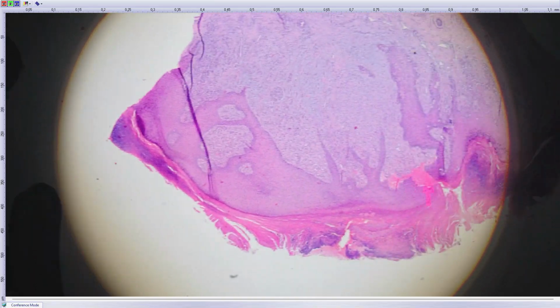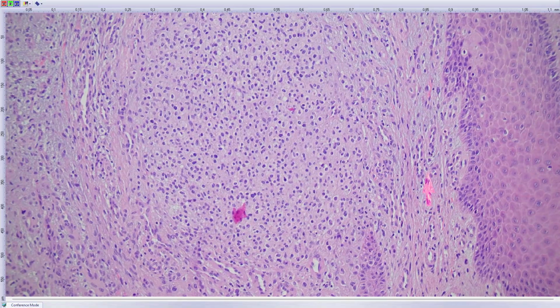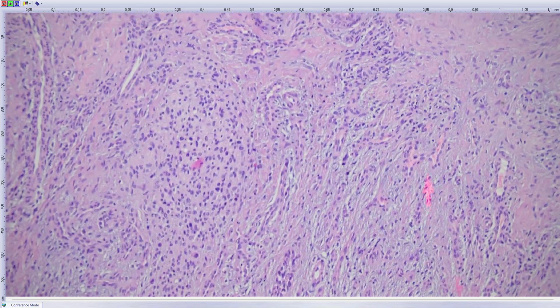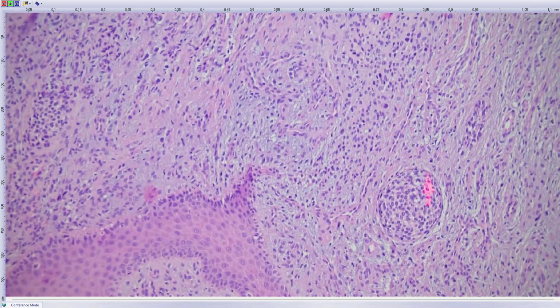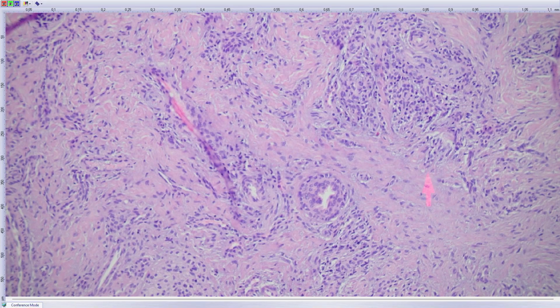And here is a skin tumor with proliferation of small cells, showing some mitotic activity but not conspicuous, yeah. And one would even say it might be a benign tumor. Yeah. There are some reactive changes in eccrine glands.